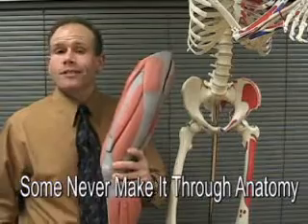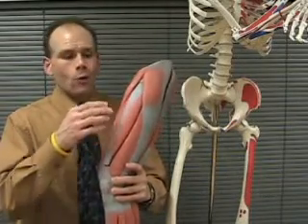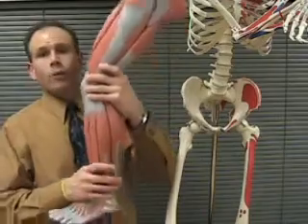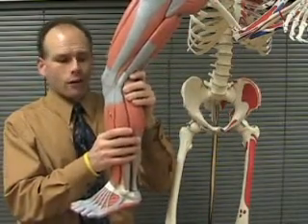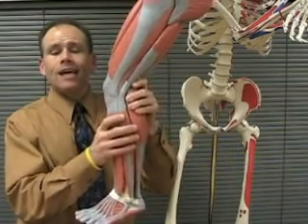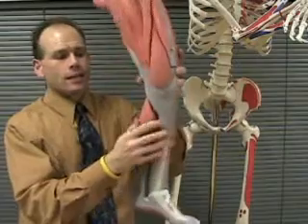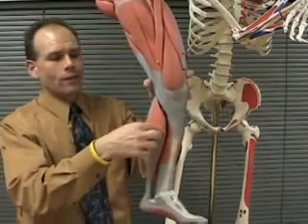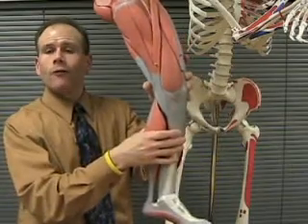So again, the skeleton has been a great help. We used his friend's thigh to look at the thigh measurement on the anterior thigh. We're going to pull that subcutaneous fat and skin away from the muscle to get our nice skin fold. Again, we can look at the thigh measurement and we can look at the calf measurement on this model. The calf measurement is again in the greatest circumference of the calf, and it is in the medial side. So we want to take a vertical fold on the medial side at the greatest circumference of the calf.